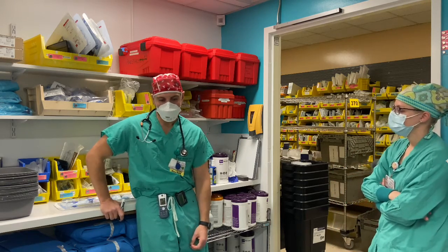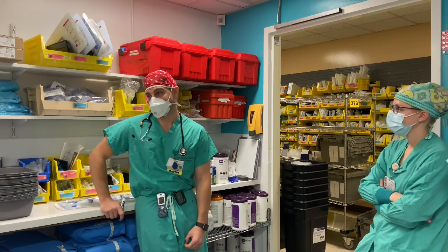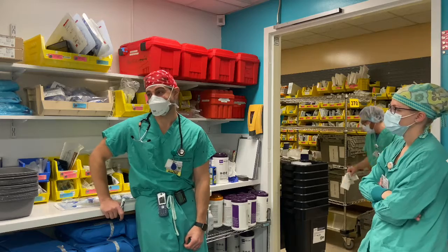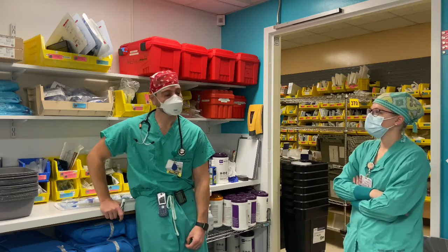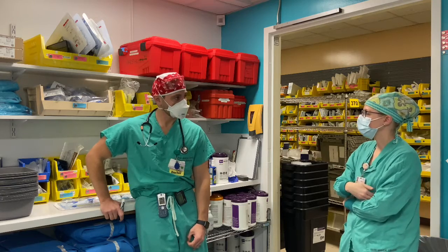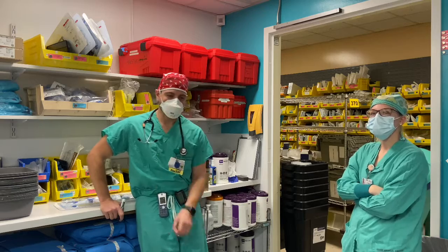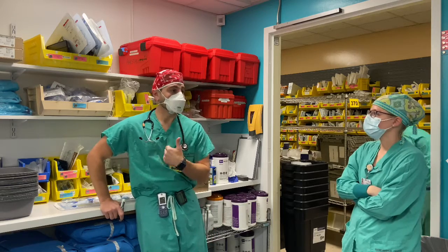So with that said, anybody here think of a reason why you might need a double lumen tube or a bronchial blocker, or why you might choose one versus the other? We use the double lumens when they're doing the thoracic cases, right? Yeah. So if you're operating on one side, you shut that side down versus the other. Exactly. If you're operating on one side, you don't want it moving.